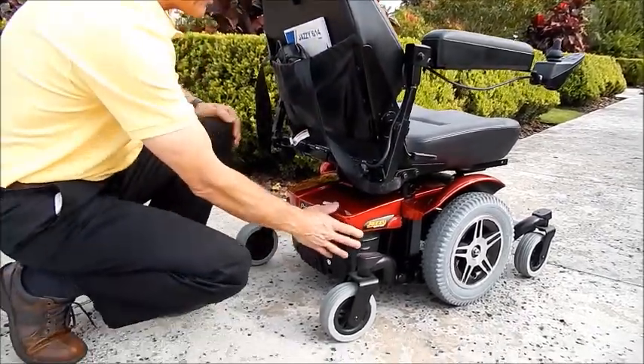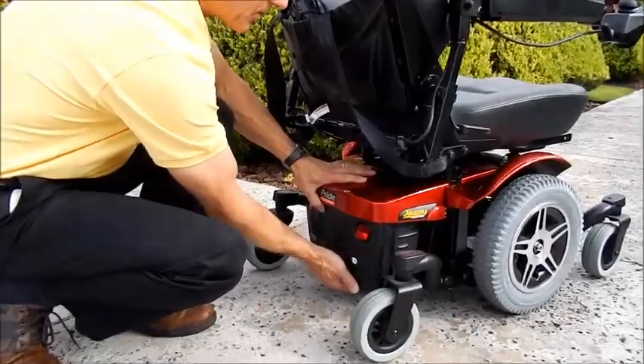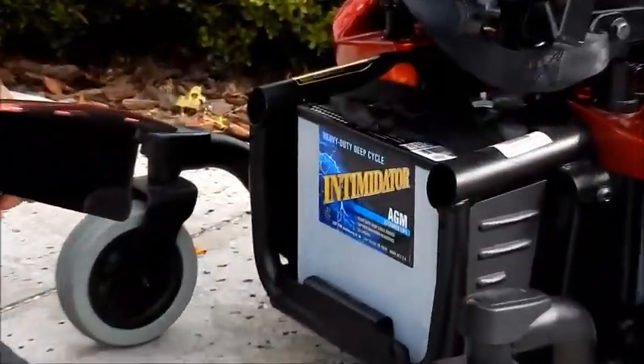This chair has batteries that are installed from the back just by lifting this cover, and the batteries are right here in the back.